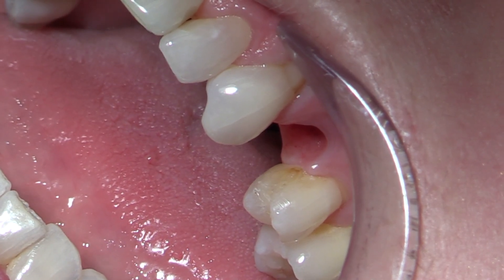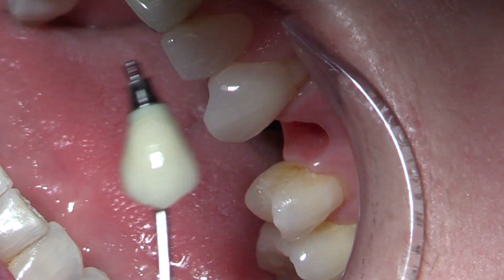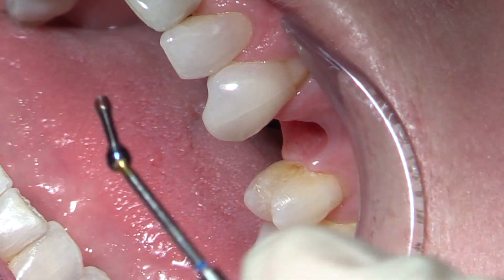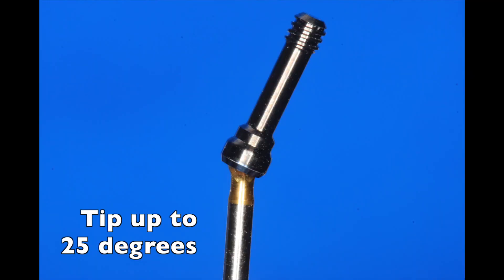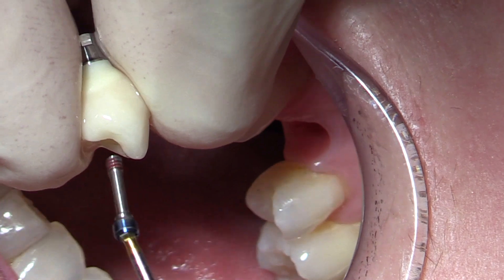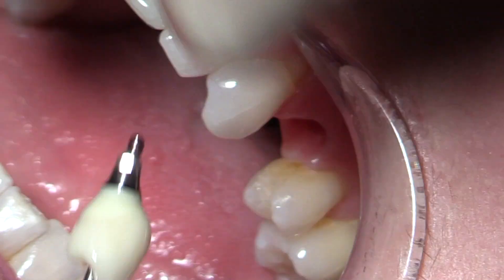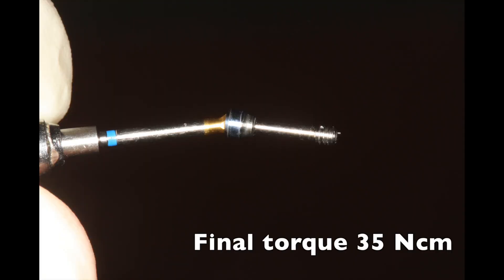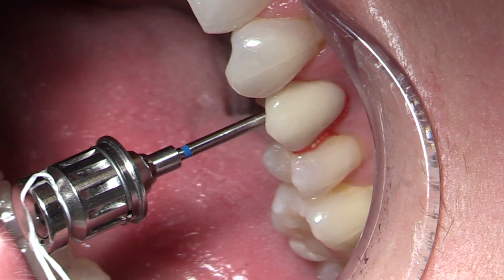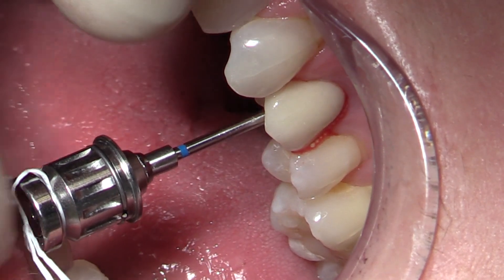This does have to be on a conical connection implant like the Nobel Active or the Replace CC. The abutment fits down in the conical connection and is angled with the OmniGrip screw, which can be tipped up to 25 degrees and still tightened. As it goes inside, you can see you can still rotate around an axis on an angle because of this articulated screw. The final torque is 35 Newton centimeters on this particular screw — the same as other screws in the same situation.